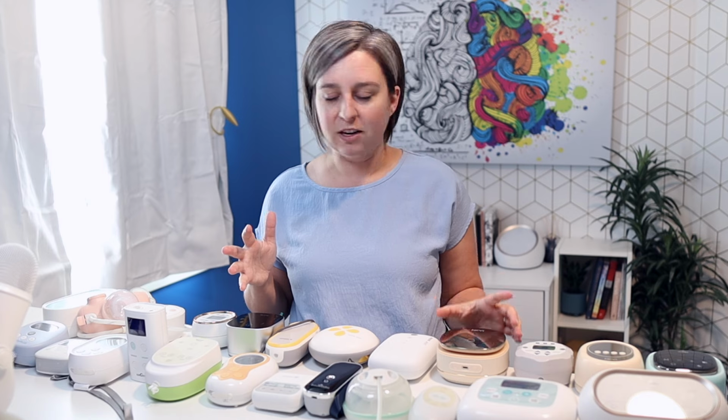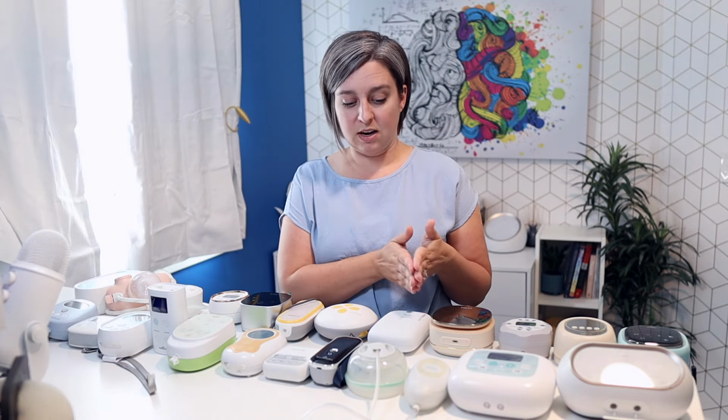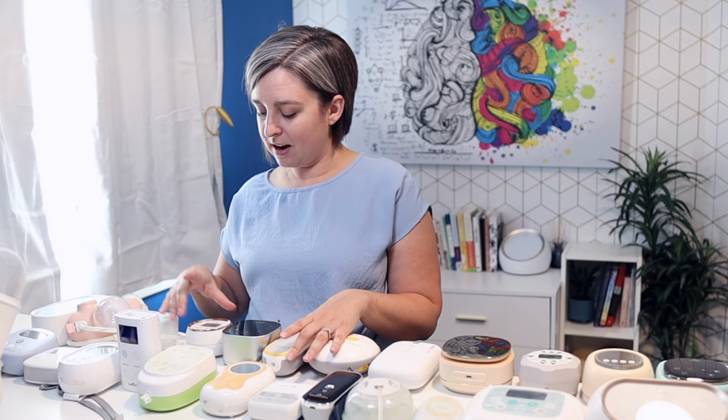The Freeme Liberty goes quite high, so does this other NCVI pump. The Philips Advent, let me look at that one for you. 122. Okay, so now we're getting into a more standard realm, I should say. I think this one was 134, 145, that kind of thing. Anyway, Medela Swing Maxi, that one was 114. The Medela Symphony is about 120, just so you're aware, which is kind of right here. Medela Freestyle Flex, iCare, Freeme Rose, the Annabella, let's just check in and see where we're at number-wise. Yeah, about 100.